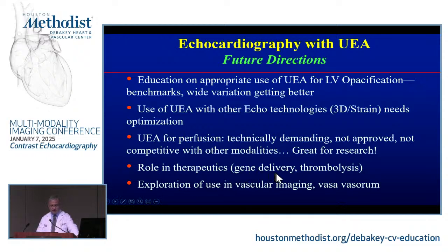Role in therapeutics: gene delivery coded to the microbubble itself, and you can destroy it at the level of, be it pancreatic cancer or other things in cancer. Thrombolysis, exploration and vascular imaging, vasa vasorum imaging, I think these are all exciting ones.